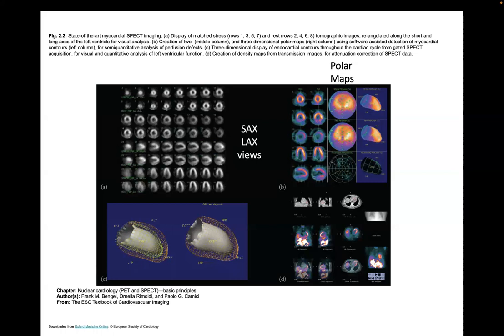Cardiac SPECT scans are done for people who have suspected abnormalities in their blood flow to their heart. You can see on this one, it looks like there might be some kind of low blood flow right at the apex of this heart here in the long axis view, etc. And so the quality of these pictures is mostly wrapped up in the ability to actually estimate the blood flow as opposed to a high resolution picture of the morphology of the heart. This is, as you can see, a very low resolution map of the blood flow.